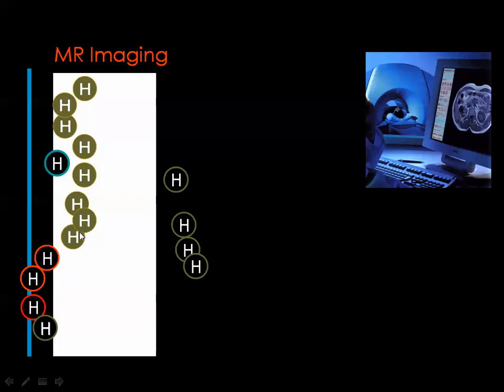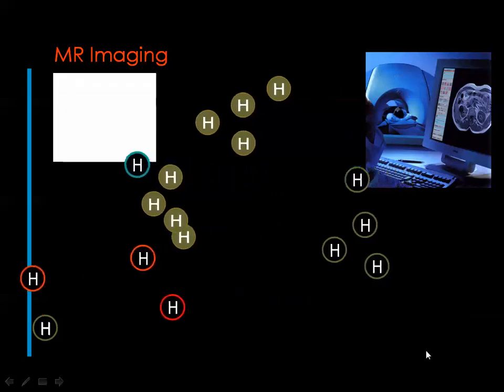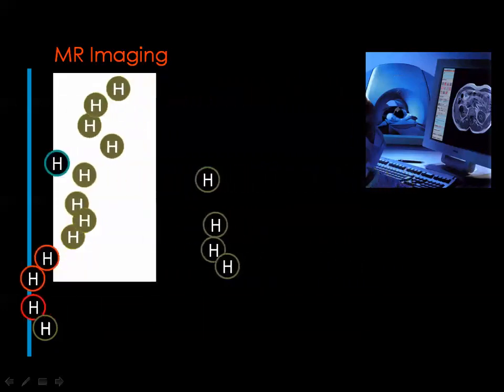Then what about the hydrogen which is not moving? It will appear black. And what about the hydrogen which is very slow and came after I shut down the camera? It will appear black. And what about this hydrogen in red? They are very fast and you cannot image them this way.